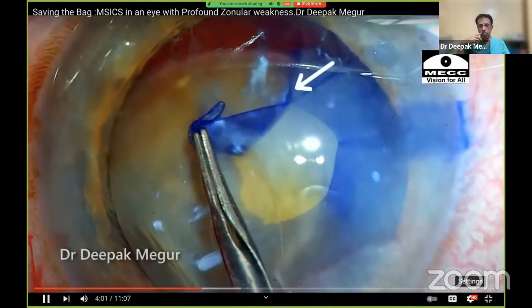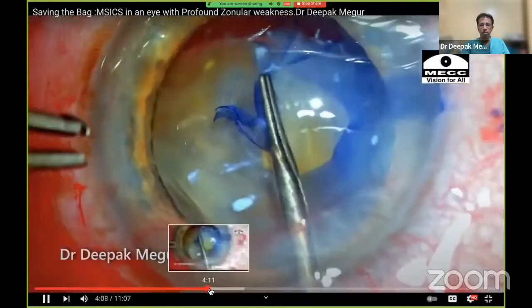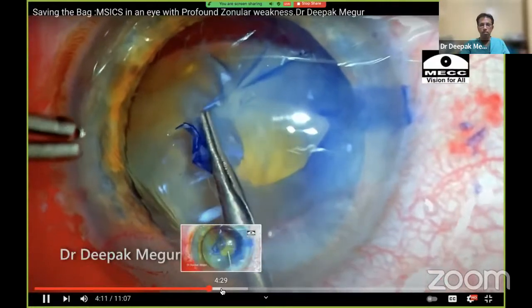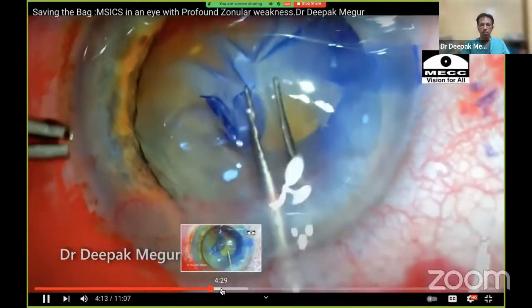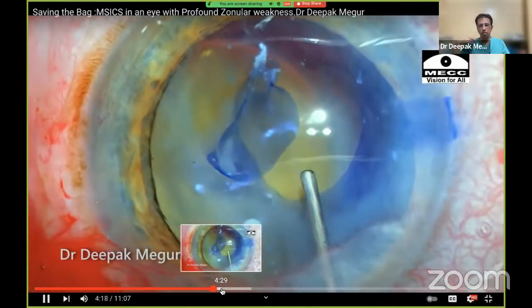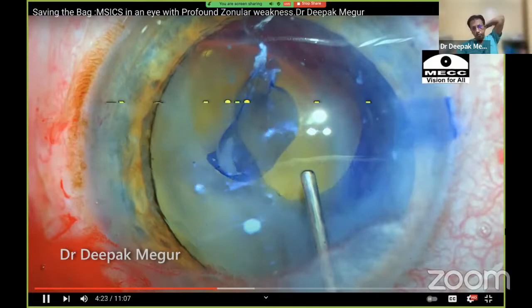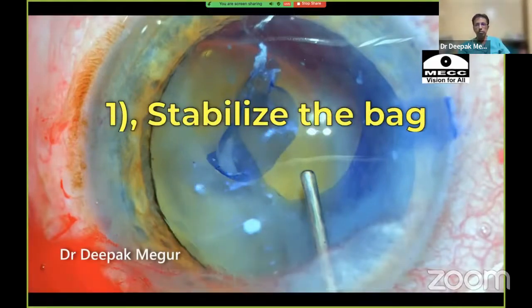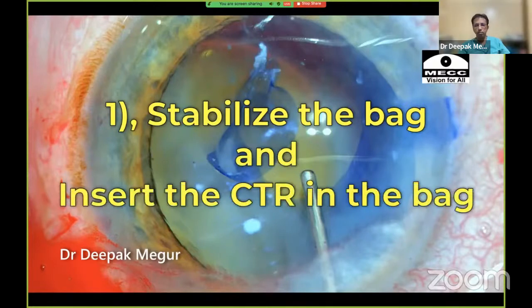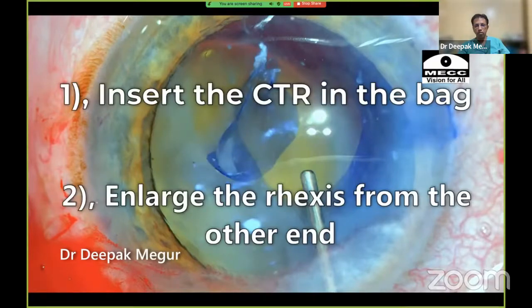Even the tearing is not easy. I managed to tear until I hit this roadblock — a calcific spot. This is not looking good. It is threatening to go into the equator if I proceed further. I'm just wondering what to do. I leave it at that, come out, and refill the bag with OVD. Let me pause here and explain what was going through my head at that point.